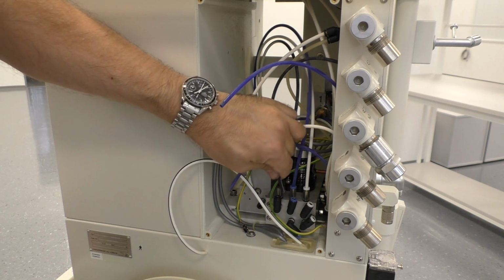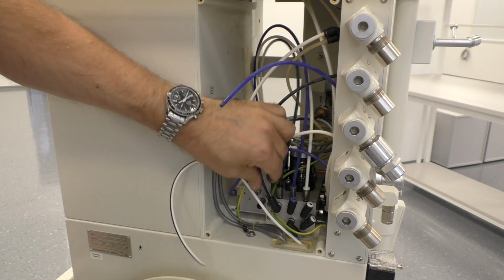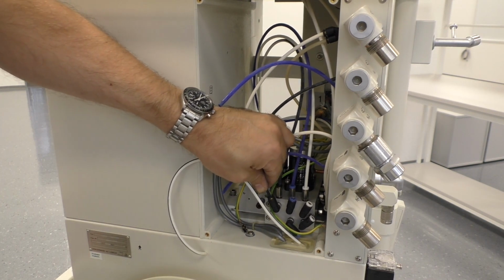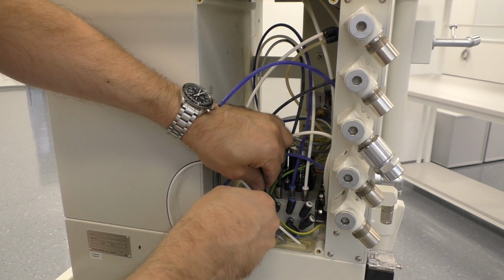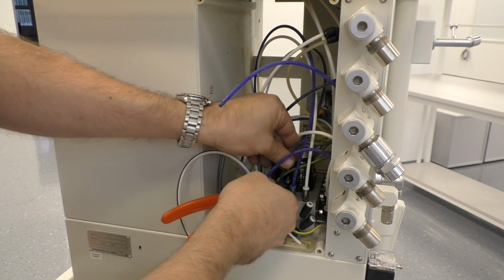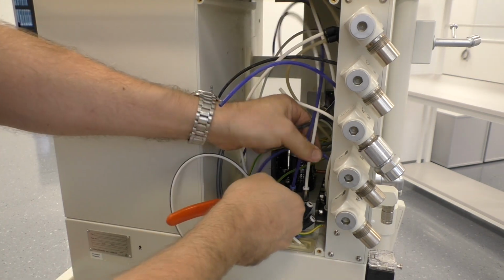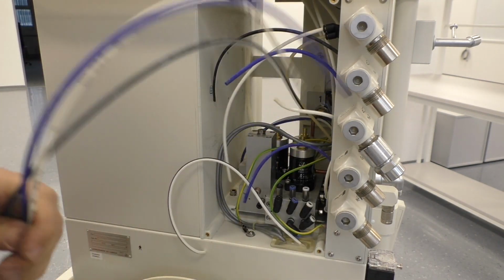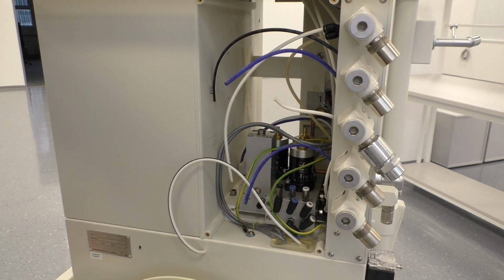And if you want to plug it in, you just do like this. The more you pull, the more it gets fixed until you push that ring back. And then it comes out. Very easy, very nice, and very reusable.